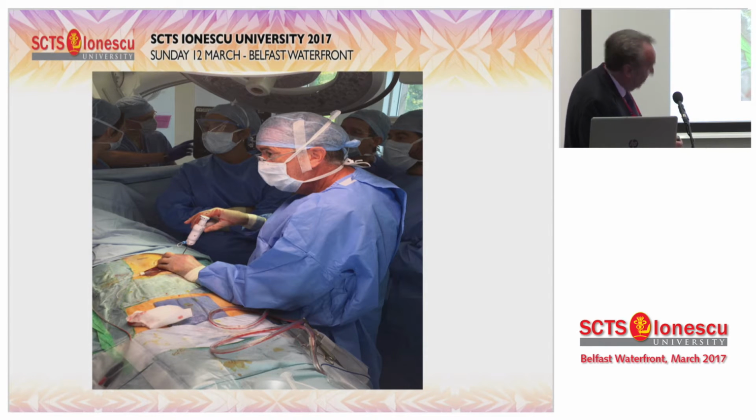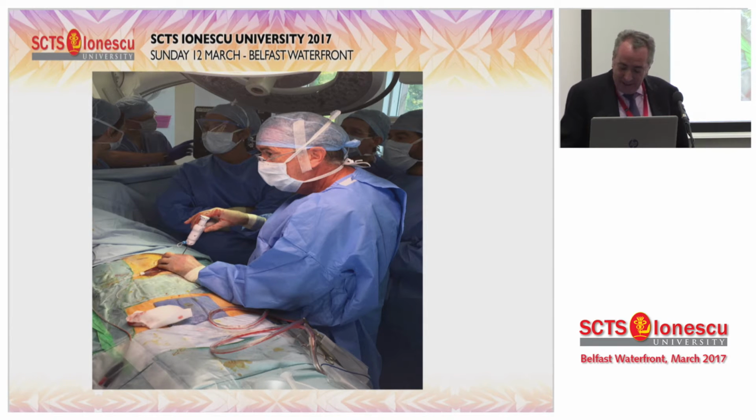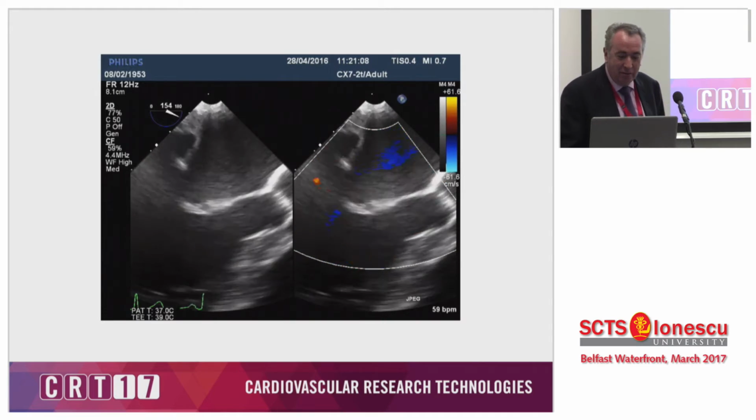The point of this slide is not the fact that my glasses weren't working that day and I had to take them off, but you can see it's really quite a delicate procedure. The most important people are here, Andre and Alison, who are doing the echo. I'm looking at the echo screen. They go right, left, medial, lateral, and I just follow this very much echo controlled.